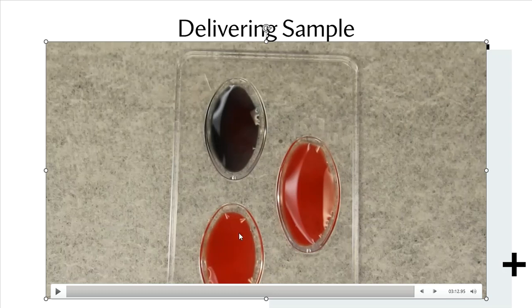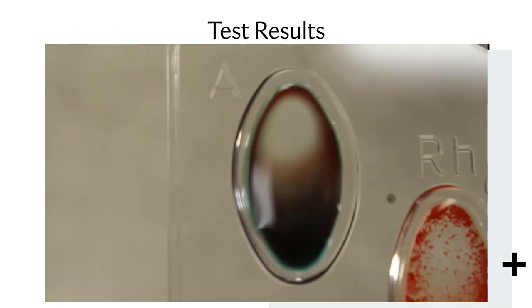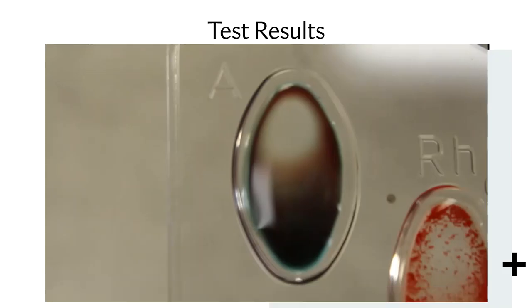All right, so as you notice, I did mix them with a toothpick and smear them in the wells. I just think that I get better visuals if I do this. A lot of people just add the drops and let it sit, and then look at it a little bit later. But I like mixing them, getting them in the jacuzzi tub, getting them to know each other, and smearing them across the entire surface. It actually reacts quicker, I think, and I see it a little bit better when it's time to read the card. So in this particular video, you're going to see my test results, and we're going to talk about what is going on, what I see, and what that means as a test result.